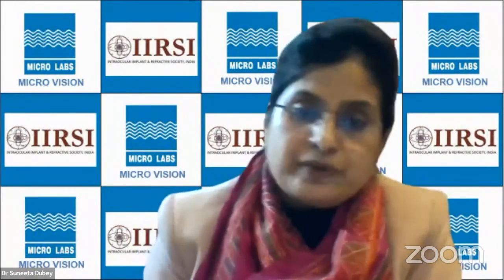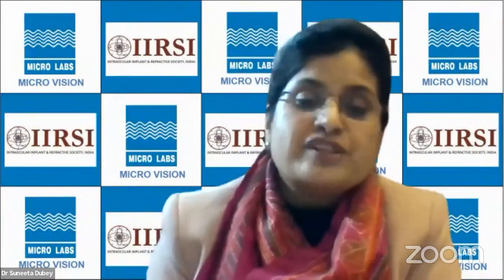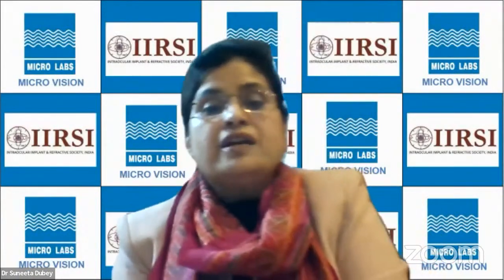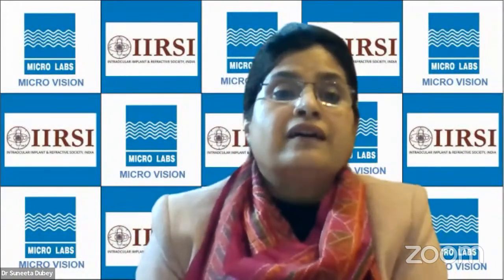As far as possible, it should be given inferotemporally only. Avoid superotemporal and give a very gentle massage. Don't put a lot of pressure. And I think whosoever is blocking should be warned that the patient is having advanced glaucoma and should be handled very carefully. But other choices are, like, people are giving subtenons and even subconjunctival.